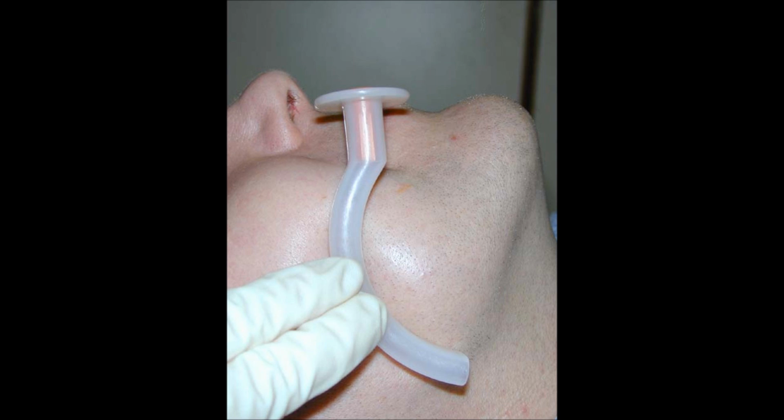After you select the proper size of OPA, you are ready to insert it. In inserting it, the OPA should curve upward toward the hard palate as it enters the mouth. As the OPA passes through the oral cavity and approaches the posterior wall of the pharynx, rotate it 180 degrees into the proper position.